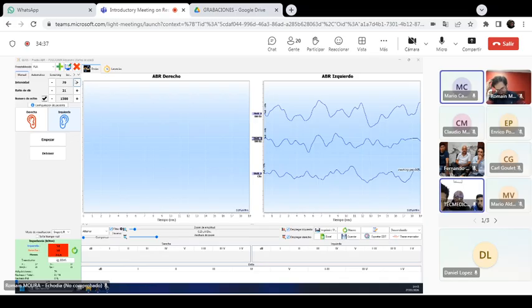Yeah, but all these parameters refer to a classic screening or up to diagnostic level audiometer. And correct me if I'm wrong, these are requirements for the other type of devices we supplied, like the standalone audiometer. But for an ABR, or for a unit capable of executing ABR, and this is our test, this should not be a requirement.